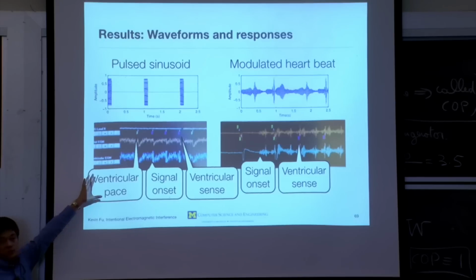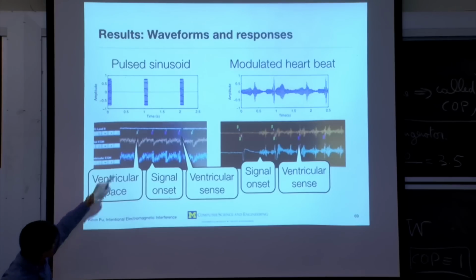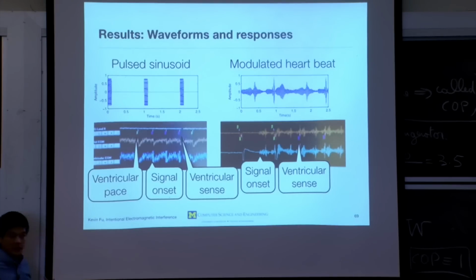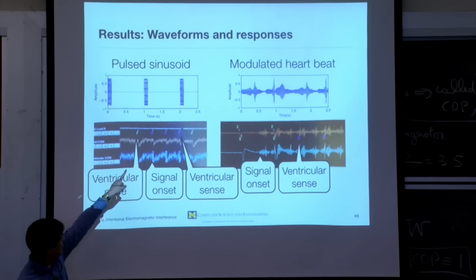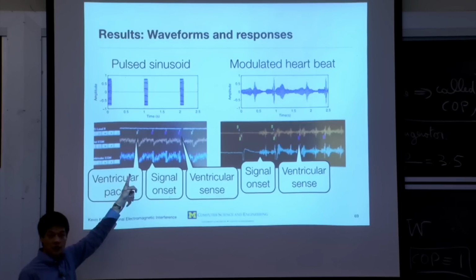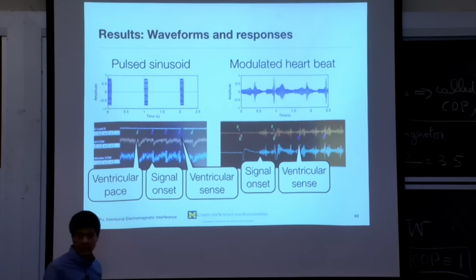This is a screenshot of the pacemaker programmer, which tells us live what telemetry it's pulling out. It's hard to read, but the little green up there, VP, says that the device sent out a ventricular pace. This is the pacemaker sending an artificial heartbeat, basically, to make the tissue contract. What's interesting is when we started sending our interference, it got what's called a VS, ventricular sense, the little purple VS. There's 3 of them. So the pacemaker thought that the heart was beating on its own, so it chose to inhibit the pacing to save power. And then when we turned off the interference, the pacing began again.